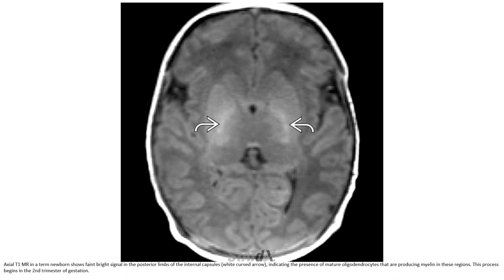This is a T1 image in a term newborn. There is bright signal in the posterior limb of the internal capsule, indicating presence of mature oligodendrocytes that are producing myelin in this region. The myelination process begins in the second trimester of gestation.